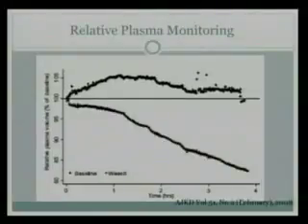So you can see it's a big difference. Now he has a nice slope, which is indicative of closer to euvolemia in this patient. And this can be helpful because if the crit line is very flat, it suggests that the patient has more fluid to give and that you should attempt to take more fluid off.